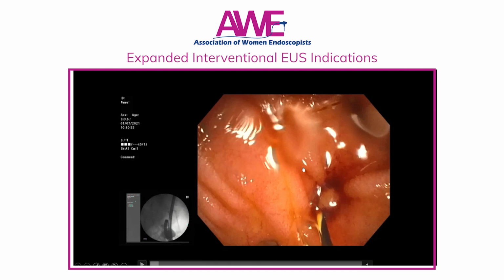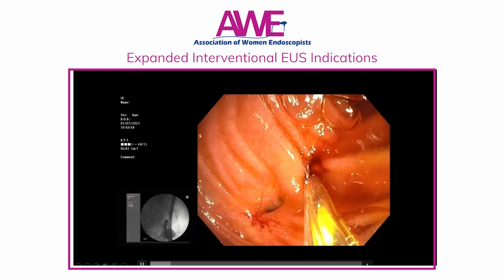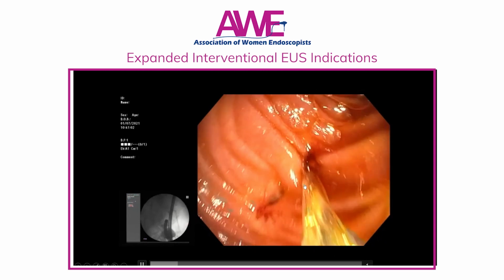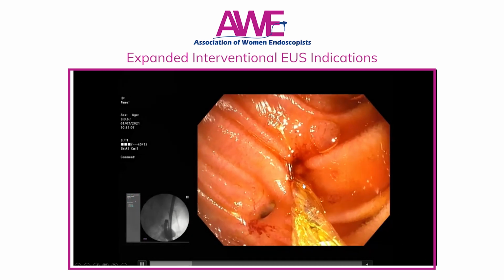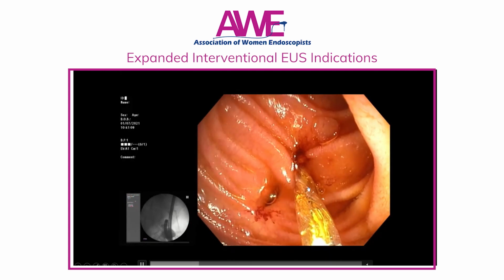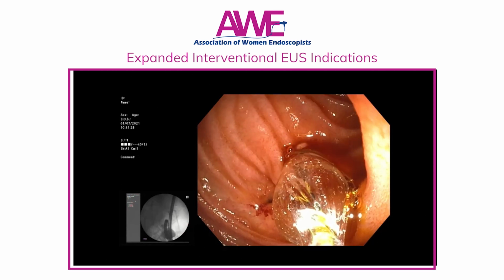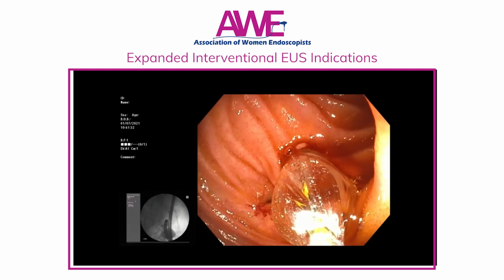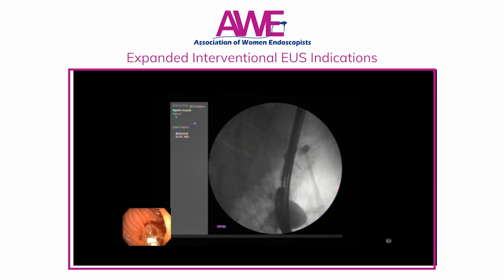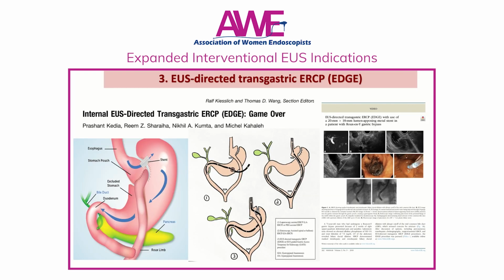And once the two magnets connect, the biliary enteric anastomosis is being created. And as you can see here, you see this connection right here. This is what it looks like. And this anastomosis can be dilated using a CRE balloon up to 1 centimeter, as demonstrated here on this video. The biliary enteric anastomosis is being dilated using a CRE balloon, followed by stent placement.